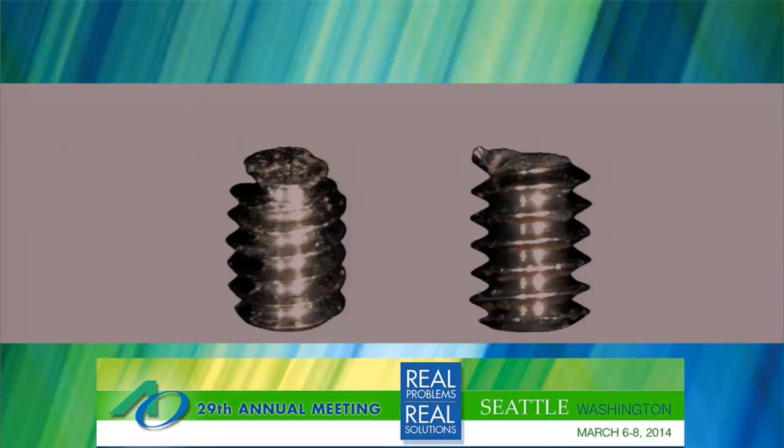Because if that fragment rotates clockwise, you have to think about this just a little bit visually, when that fragment rotates clockwise down, that sharp edge is trailing as it's going down the threads. It's the caboose on the train, and so that fragment will actually rotate down easily. But if you try to rotate that fragment up, that sharp edge at the top is leading. And because tolerances are tight, remember, that can actually bind in a thread and cause you to not have upward mobility on it.